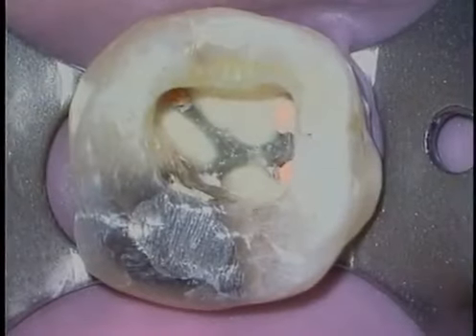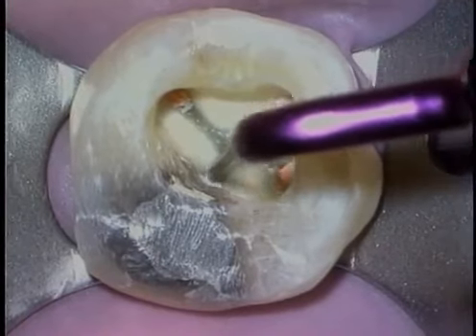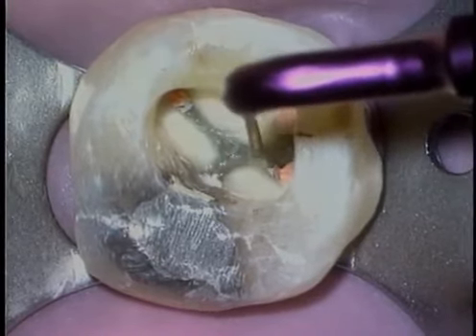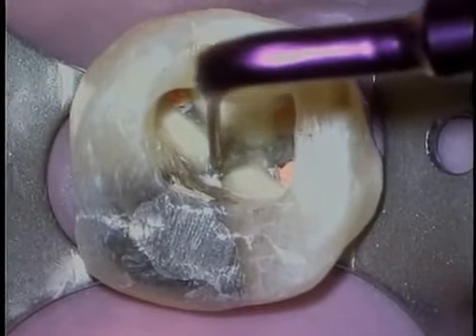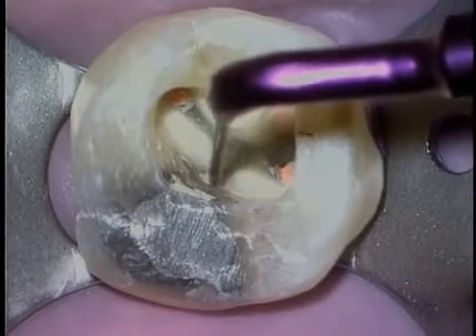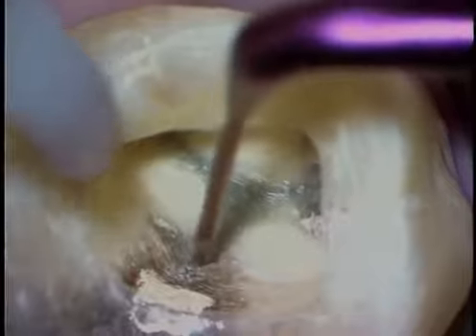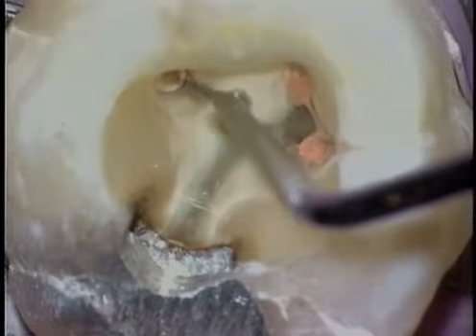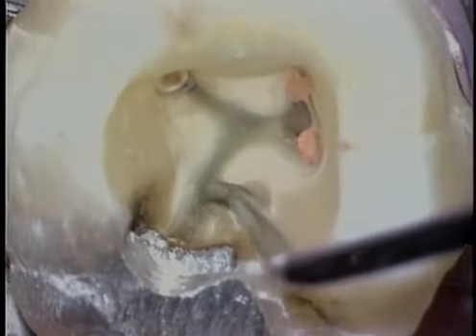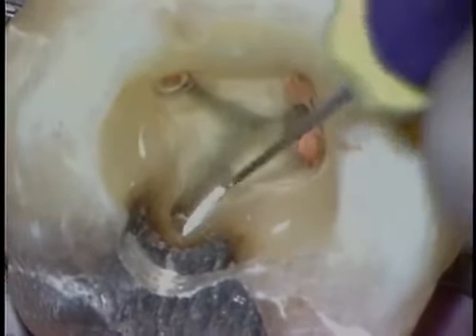The concepts previously described are important in terms of having smooth axial walls. Pulpal floors of furcated teeth frequently hold important information. Notice the dark organic lines that we can see moving between the gutta percha filled orifices and something off towards the distal lingual. Ultrasonics can very easily sculpt away material, and you can see that we're already starting to move into a canal. Its mouth is opened with a micro opener, and again we can follow these landmarks and they can very precisely and predictably carry us into missed canals, or in this instance a missed root.